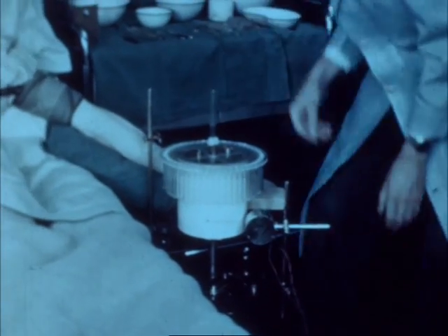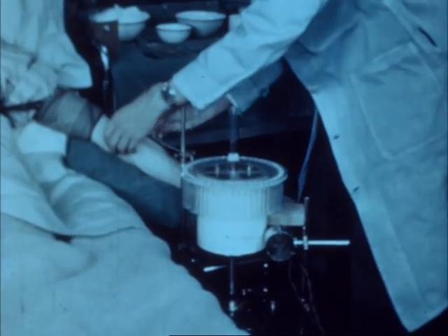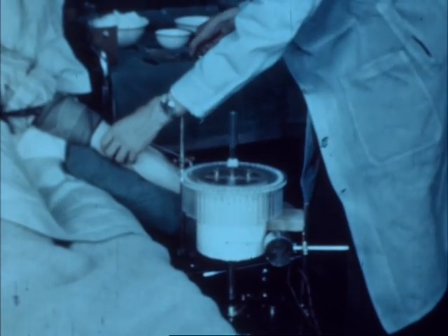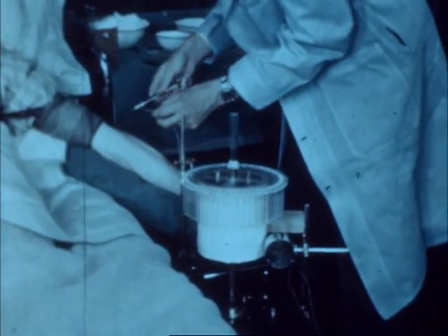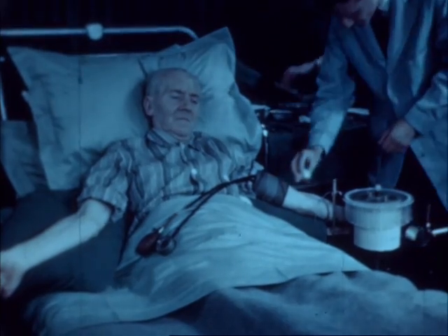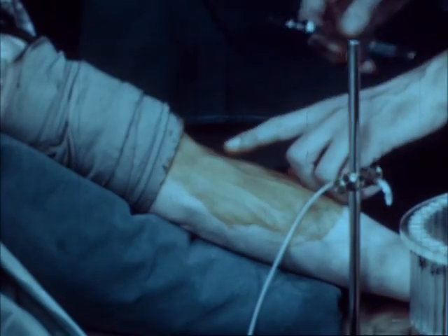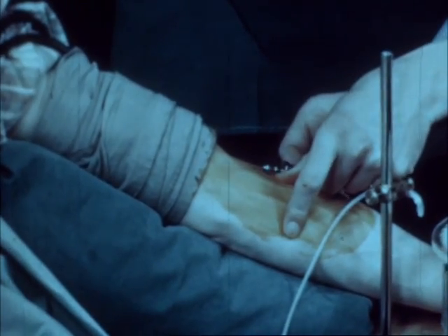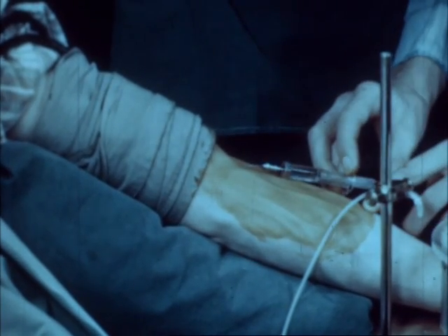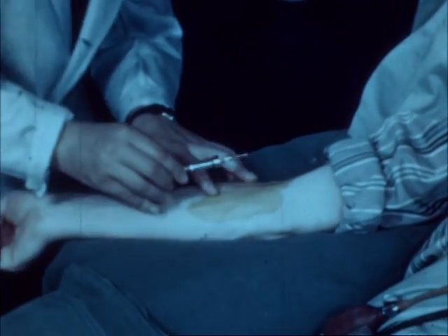The heparinized serum tubes in which blood is to be collected are mounted on a drum which revolves at a uniform speed. A piece of plastic tubing cut to a suitable length passes through an angled glass bend just above the collecting tubes. The arm is prepared by swabbing with iodine and injecting a local anesthetic over the brachial artery. Simultaneously, the right arm is prepared for the intravenous injection through a locally anesthetized area.